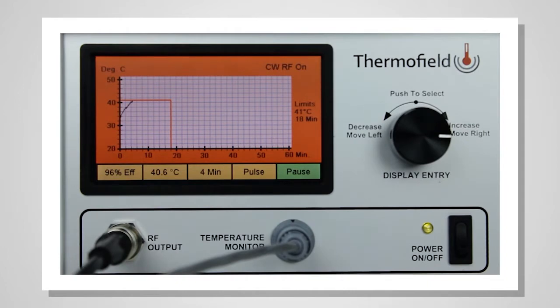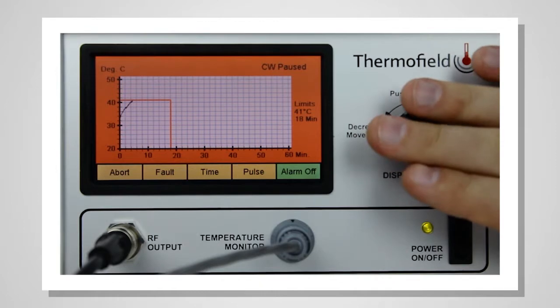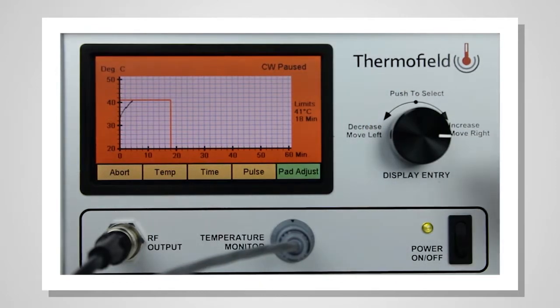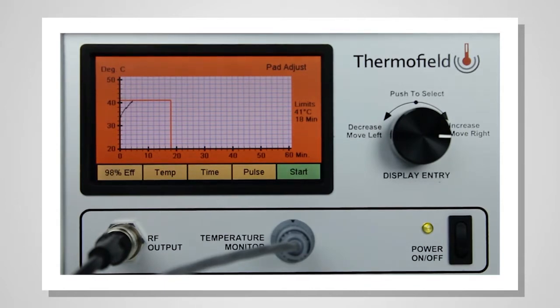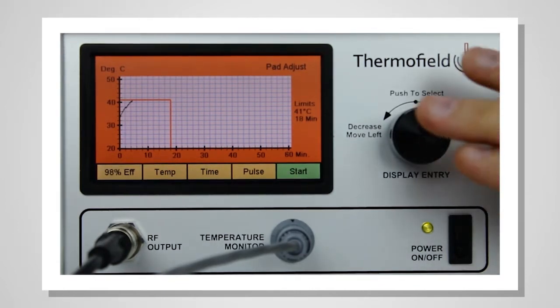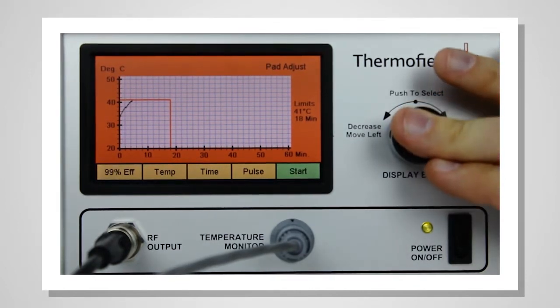If the pad gets disconnected or the treatment begins to fail, an alarm will sound. Push the knob to stop the alarm, then push the knob again to select PAD ADJUST. As soon as the efficiency is high enough, the pane will read START. Push the knob to continue the treatment.